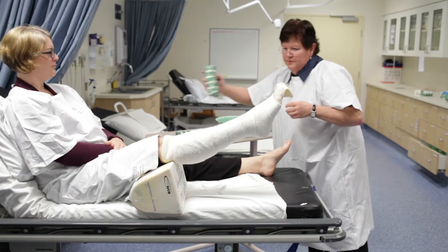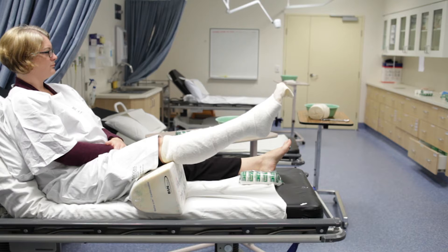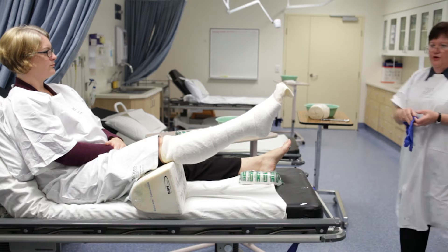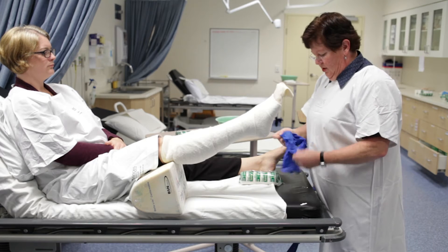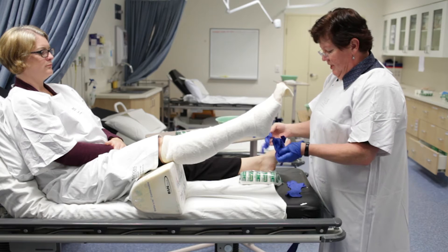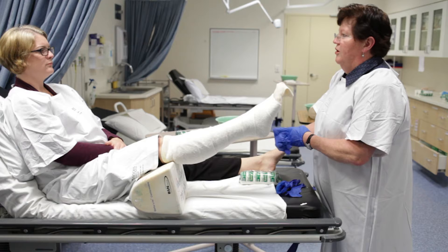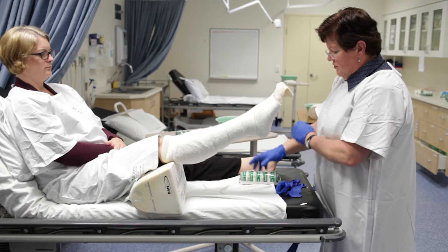When you do plaster of the toes, if you're not confident enough to do it, use cold water. If you're confident, use warm water. You've got about ten minutes of play time with the gypsum if you use cold water. If you use hot water, you've got about half the time. So I use cold water.